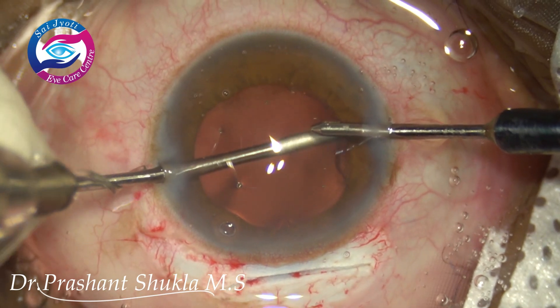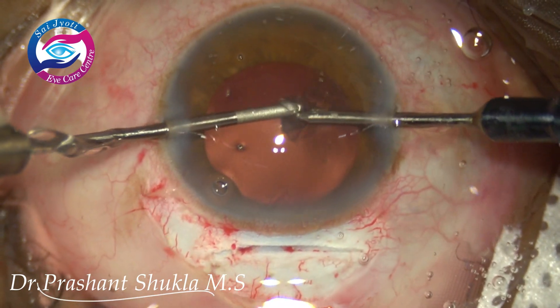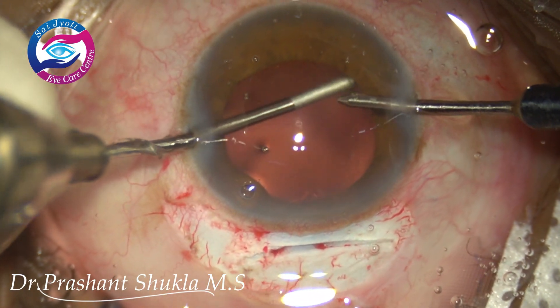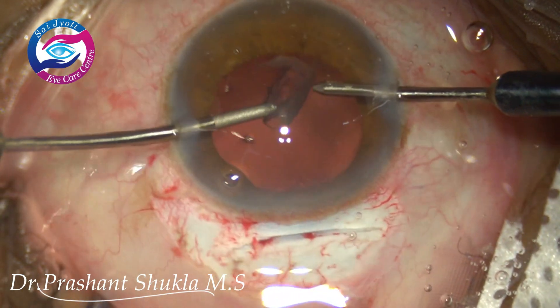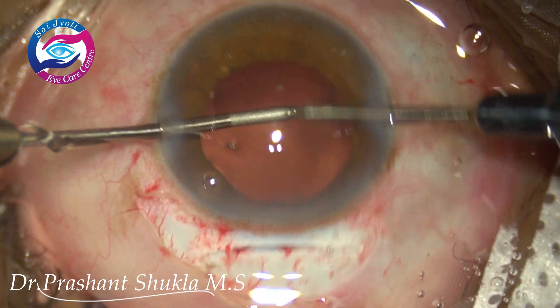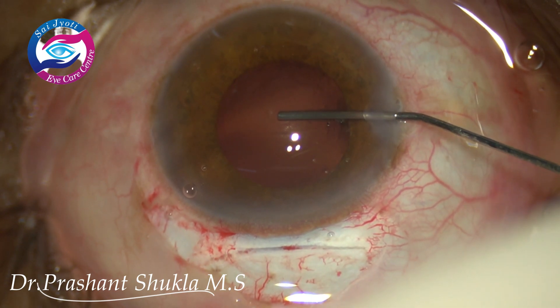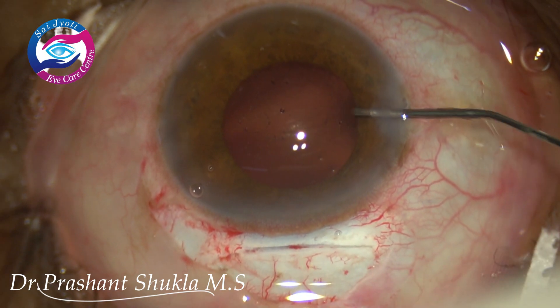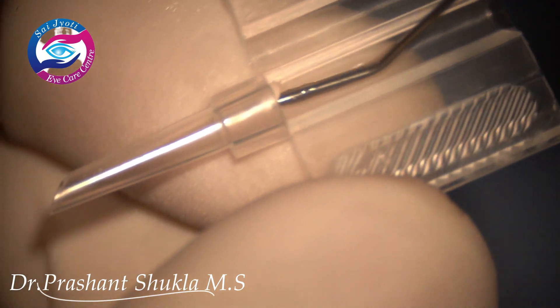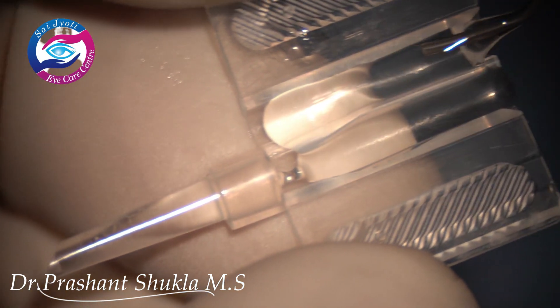Hands are switched and the cortex on the other side is being removed. The capsular bag is then refilled using high molecular weight sodium hyaluronate, which is also easy to remove afterwards.